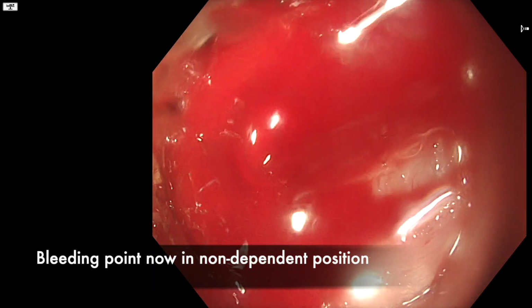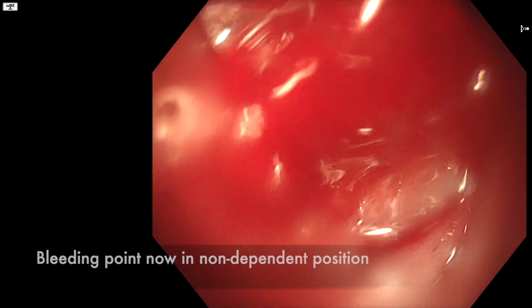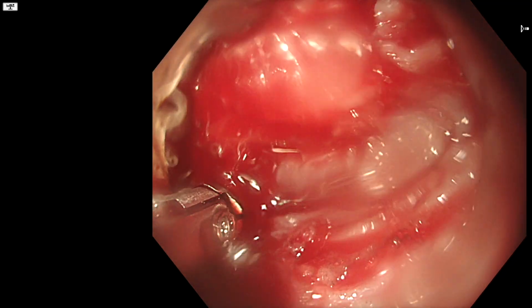So we've managed to position the patient so that the bleed is in a non-dependent position. As you can see, it's a very brisk bleed, but this way I'm reaching for the coag grasper again, and hopefully we'll be able to control it like this.